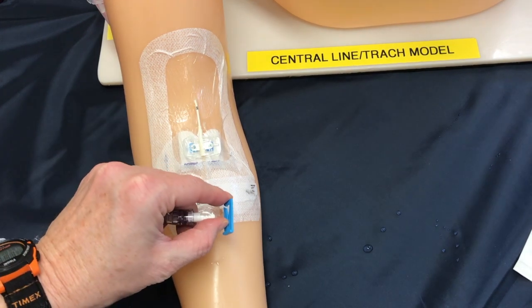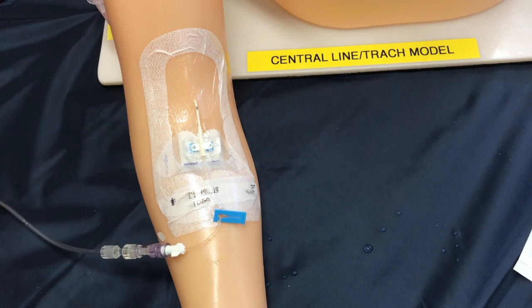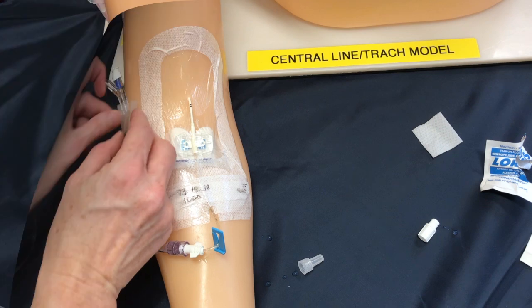Don't forget to unclamp the line so that your infusion can go through. And of course we don't want this line just hanging and dangling from the bed, so we're going to secure it to our patient's arm with a piece of tape.